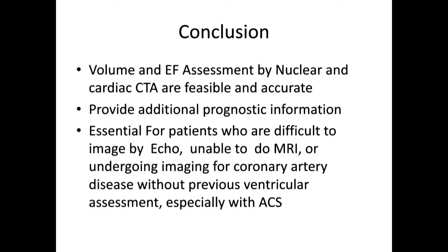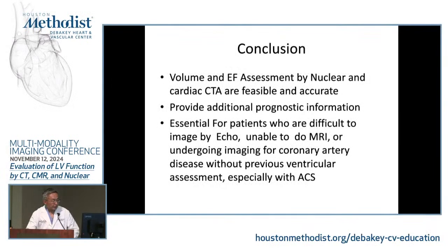Okay, in conclusion, volume and EF assessment by nuclear and cardiac CT are feasible and very accurate, and provide additional prognostic information. I think it's essential for patients who are difficult to image by echo, unable to do MRI, like patients with LVAD, or undergoing imaging for coronary disease assessment, for ischemia, CAD assessment, and you have the opportunity, and the patient has no known prior ventricular assessment, especially patients who show up with acute coronary syndrome. I think getting some type of wall motion and EF is very important.